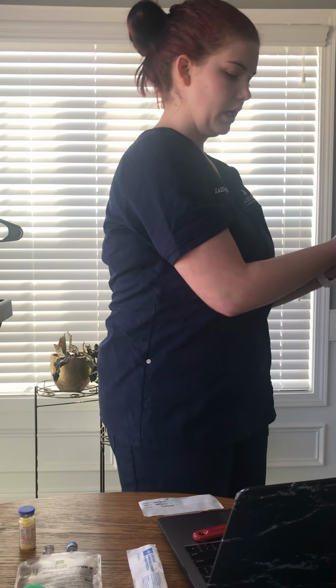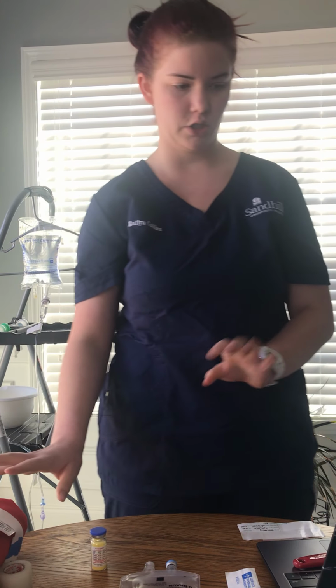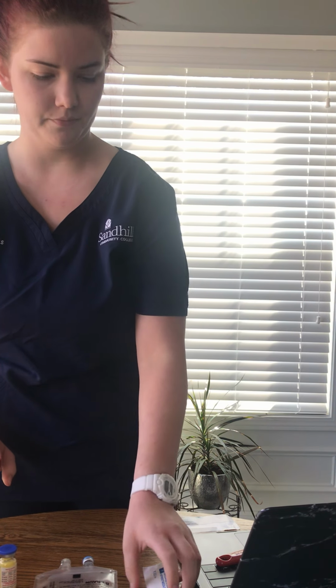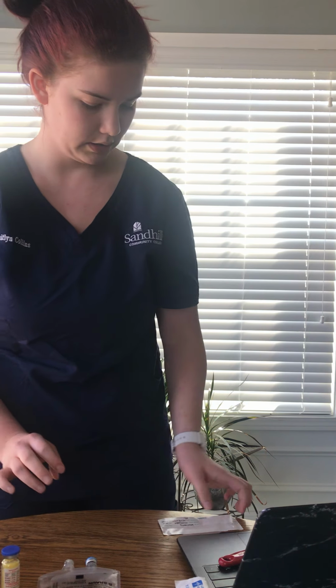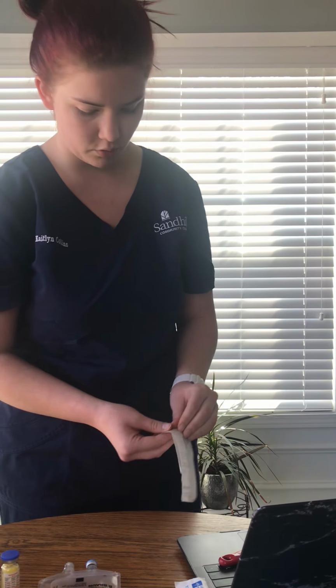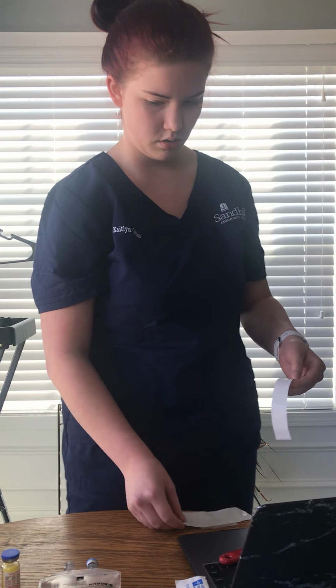All right, so I'm going to wash my hands and get started mixing the medication. So I already did check this, and the patient, the time, the route, everything. Okay, so those are my 2 checks, and those are done. I'm going to go ahead and label my bag here.